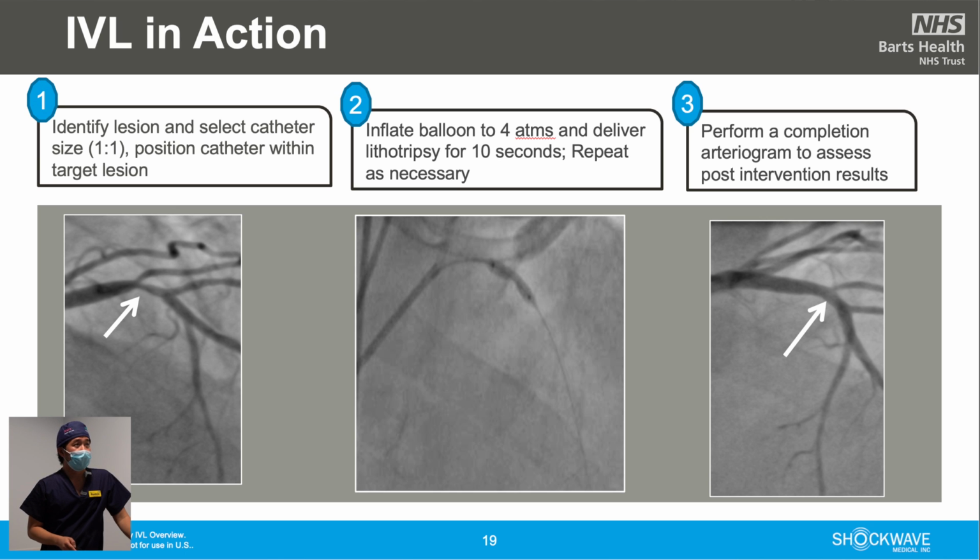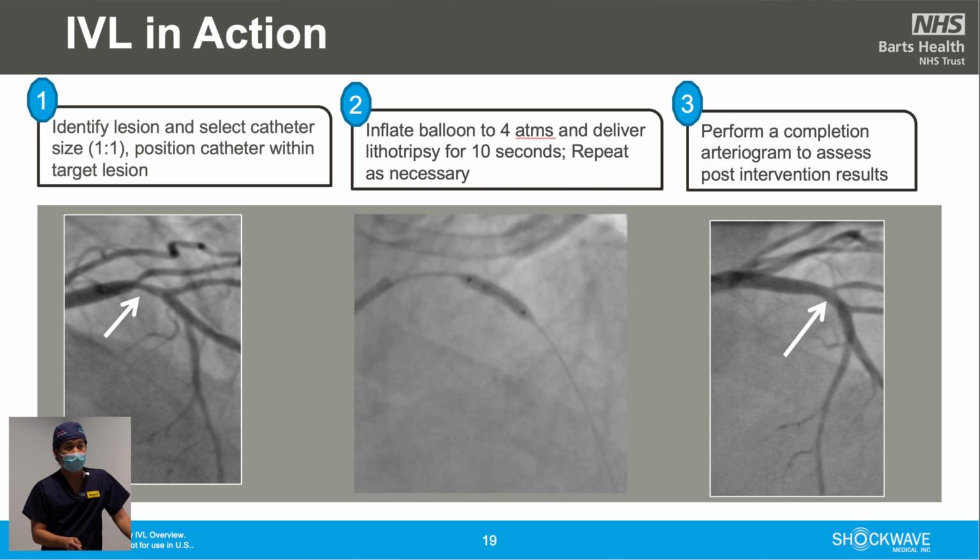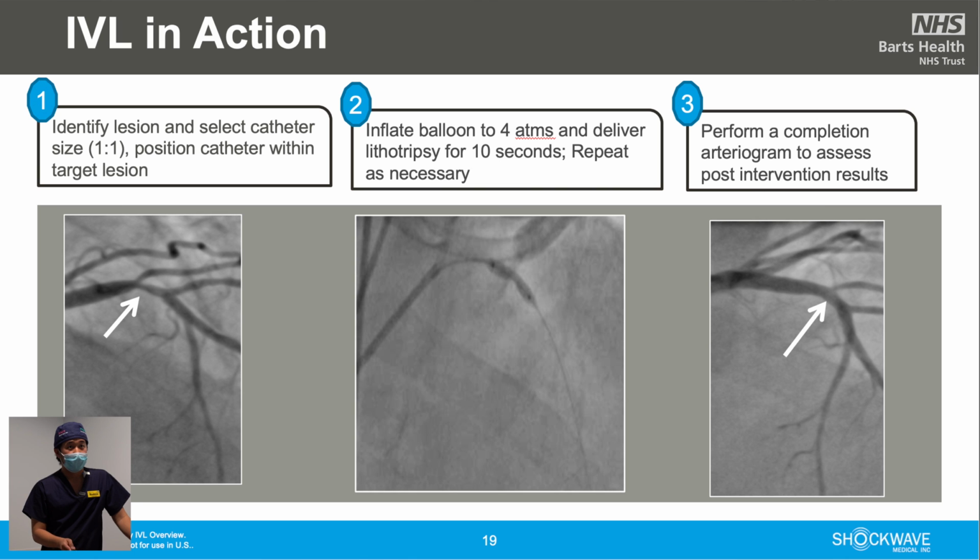And this is shockwave in action. As you can see, it's really calcified there. And look at the balloon. It slowly expands while the doctor is giving pulses. Yeah, slowly expands. And this is after the shockwave.